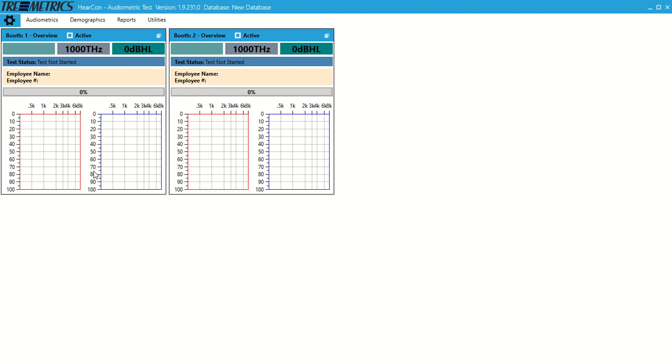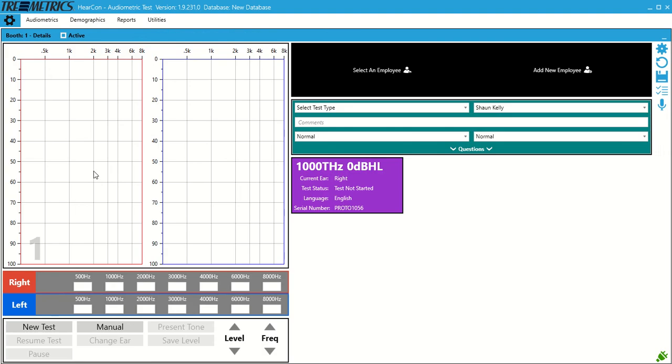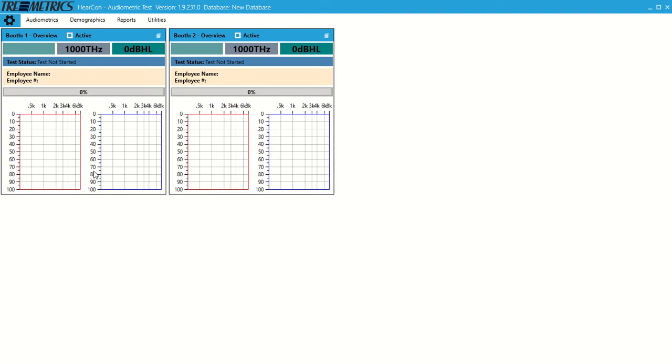With the group test on the RA-660, you can hot swap the instruments. Right now I'm going to unplug an audiometer, and then it goes back to the single test view. If you were doing single station testing only, this is the only screen you'd see. And then as soon as you plug in a second audiometer, it goes back to the tile view.